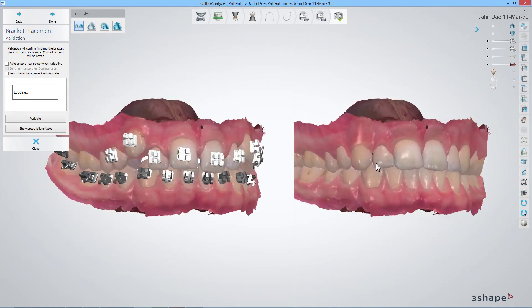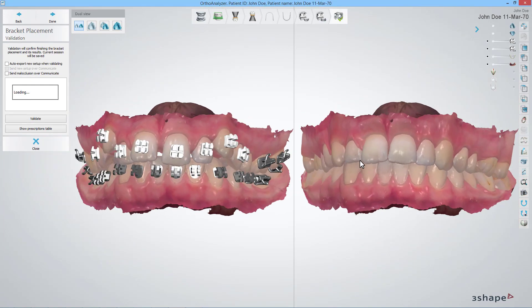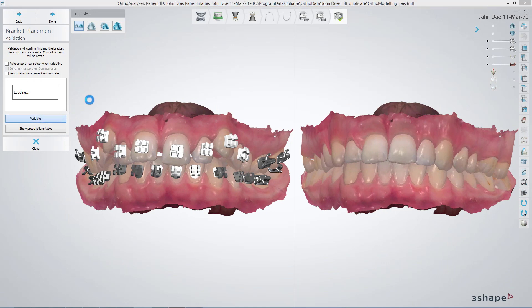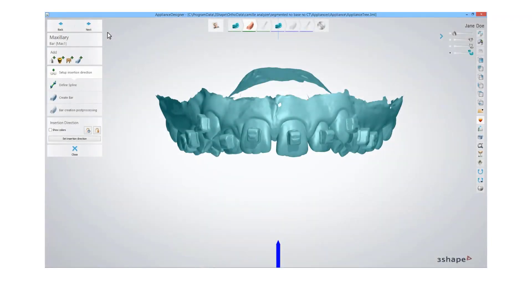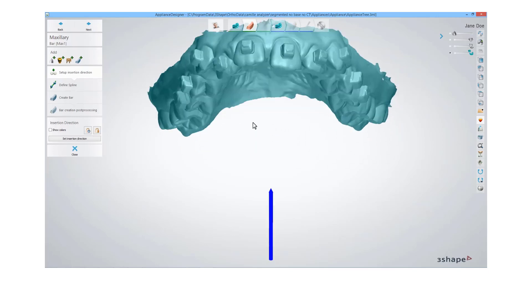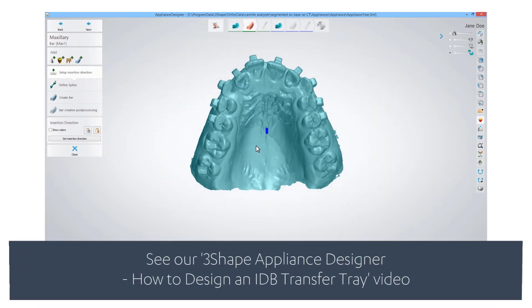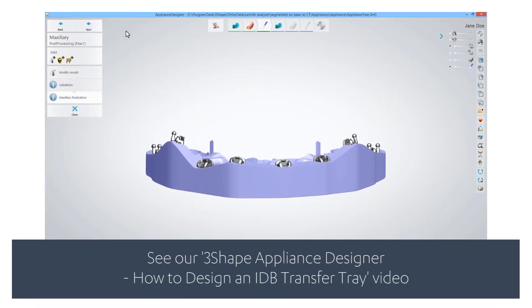Once you are in the Validation step, click the Validate button. This will make the bracket placement available for Appliance Designer Software, where you can create the bonding tray. Please see our video for more details on this topic.